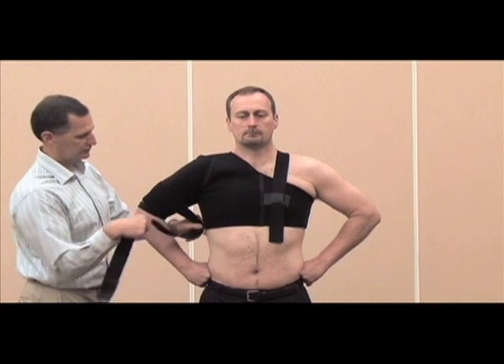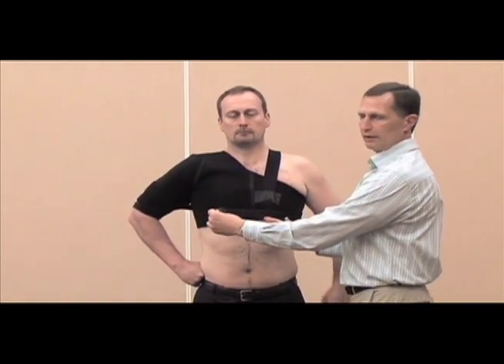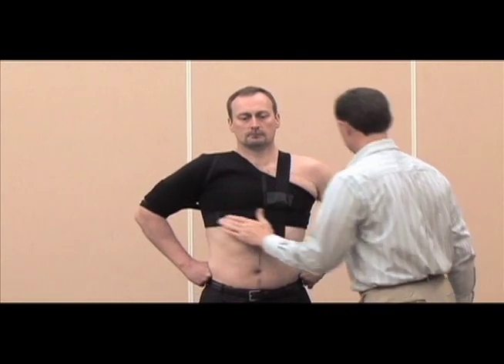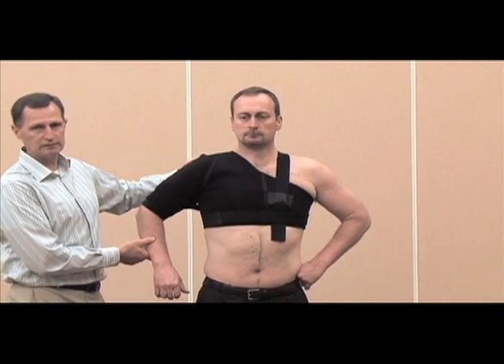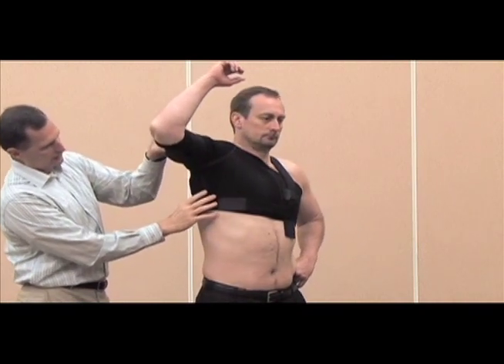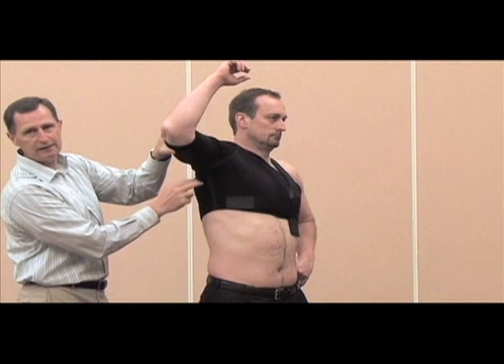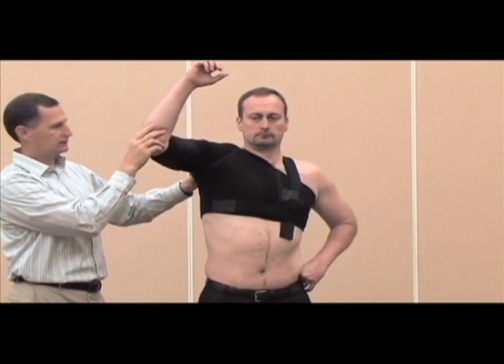For the next strap — the high strap — use the same pattern: under the arm, through the armpit, under the opposite shoulder. Cut it to whatever length is needed and secure it down. What we've done is stabilize the shoulder where it's most needed, so when the athlete tries to externally rotate and abduct the shoulder, the line of pull will actually pull the head of the humerus back into the glenoid. That's a big difference between the Soli and all the other shoulder harnesses — very key.